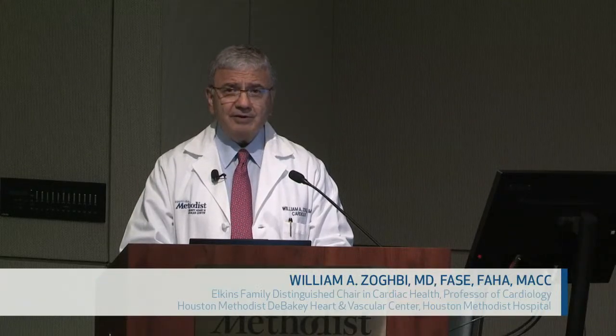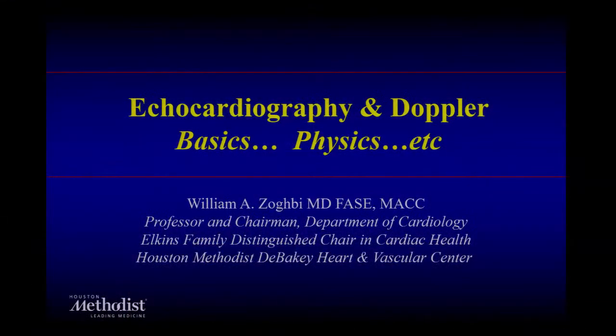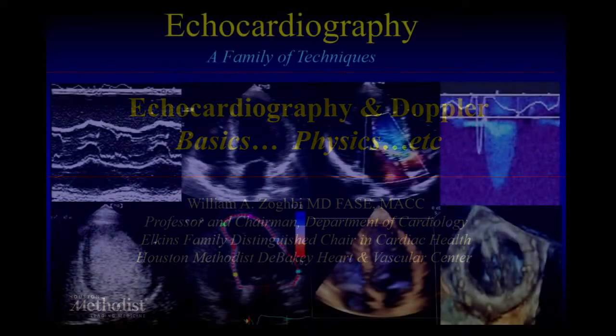And it is customary for us to start the academic year to talk about basics of cardiovascular imaging. And it is our tradition here to start with echocardiography. So we'll go through some of the basics, its physics, etc. Try not to make it too complicated for you, but at the same time give you enough information so that if you're in the echocardiography laboratory, you understand what's behind the images that you're seeing.